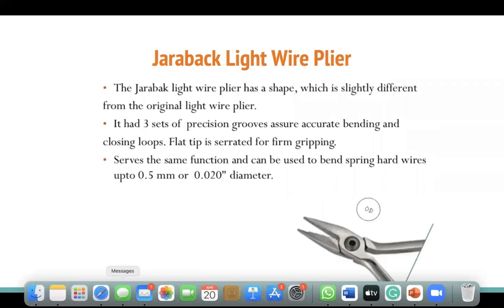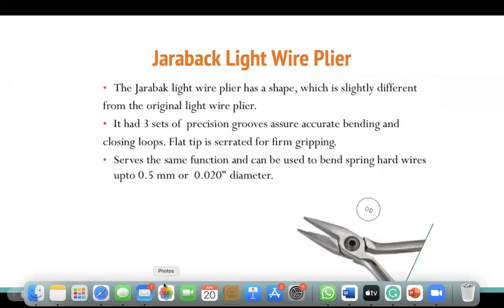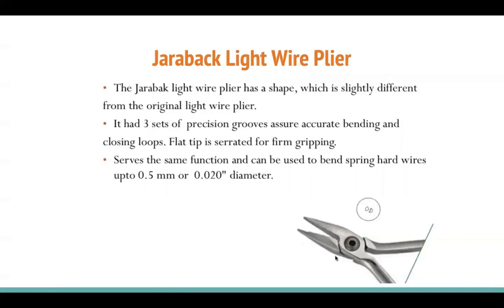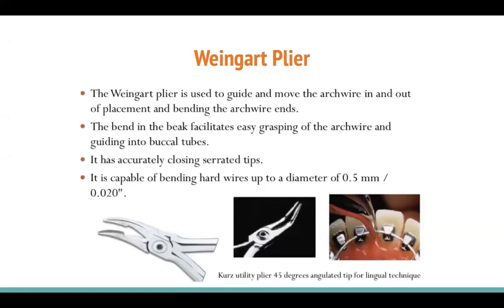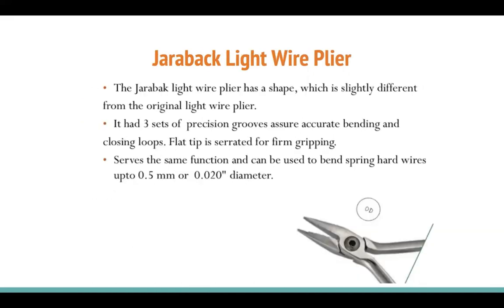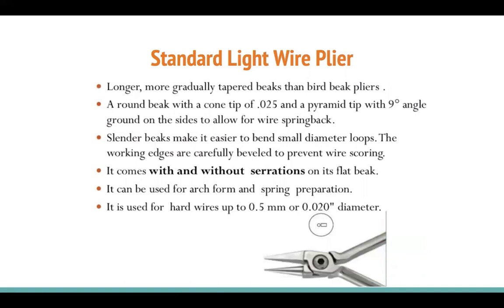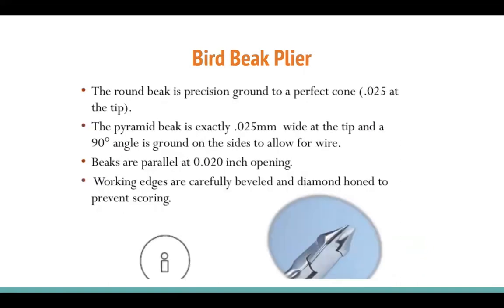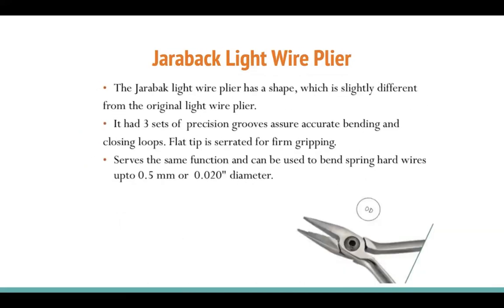The Jarabak light wire plier is slightly different from the standard light wire plier — it has three sets of precision grooves on it, which help in accurate bending and closing of loops. The flat tip is serrated for firm grip. It serves the same function and can be used to bend wire up to 0.5mm diameter. You can buy either the Jarabak wire plier, the standard light wire, or the bird beak — you don't need all three varieties as a starter.